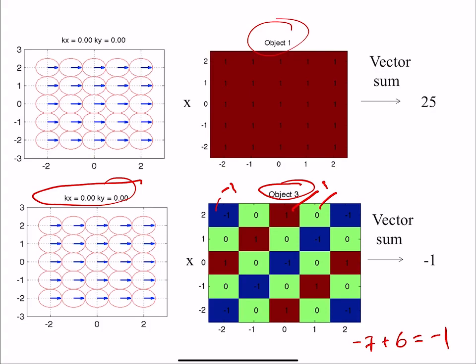Yes, question? What is a -1? A -1 just means, so 1 means the magnetization is pointing this way, -1 just means magnetization pointing the other way. So the nice thing about MR is that everything has a very physical interpretation. Okay?